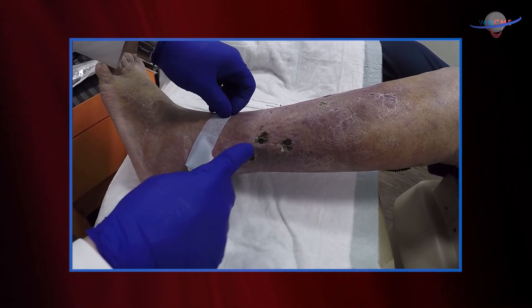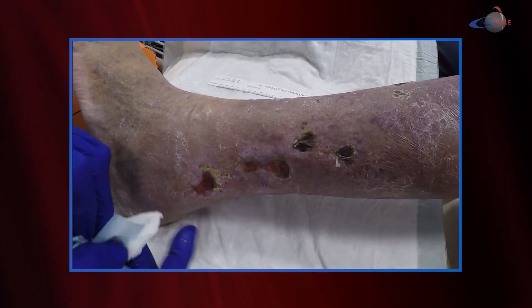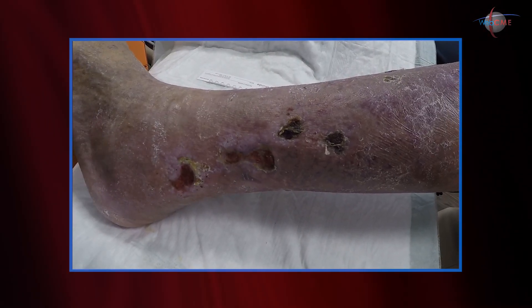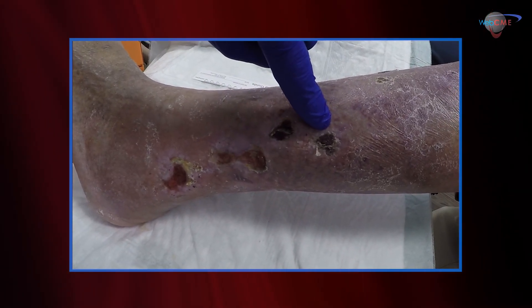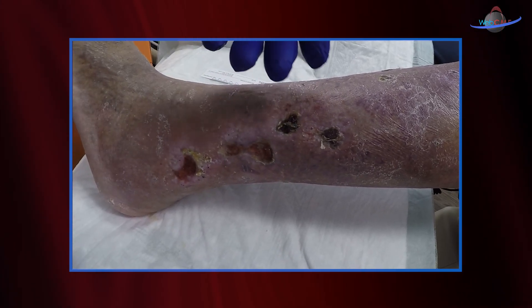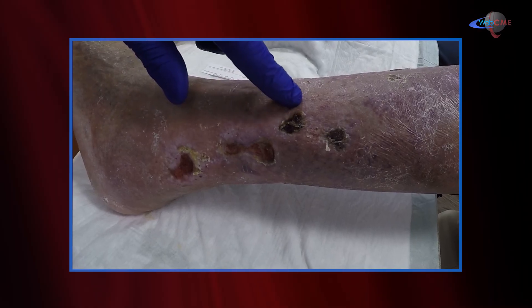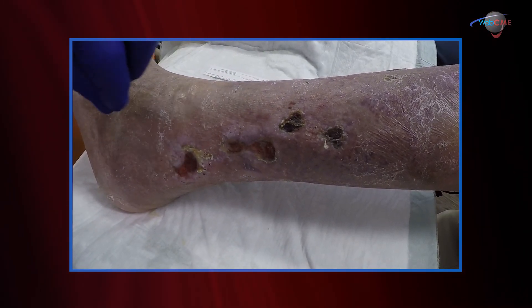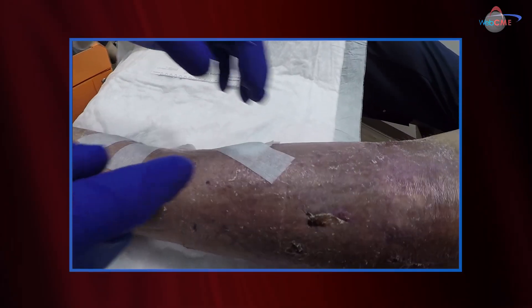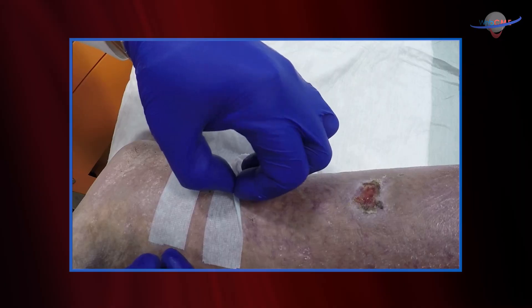You'll notice that these wounds have eschars and these do not. We applied the dermal matrix last week to these wounds here — you can see the matrix has been well incorporated. There's an eschar formation. We're going to take that off and find out what's underneath — hopefully a healed wound. I'm also going to debride these wounds and reapply the matrix dressing. We also have some wounds on the medial aspect of the leg and we're going to go ahead and graft these as well.